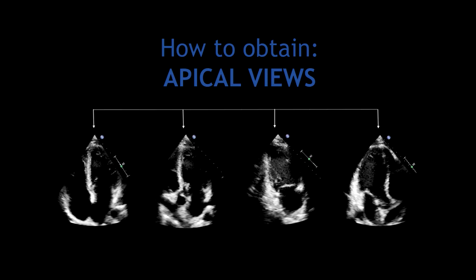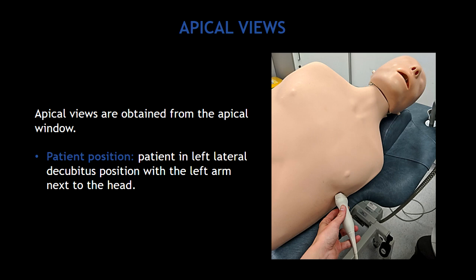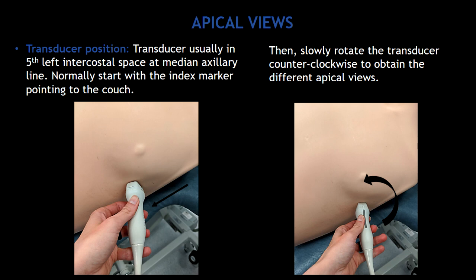Hello guys, in this video I'm going to show you how to obtain the apical views. The apical views are obtained from the apical window. The patient has to be in the left lateral decubitus position with the left arm next to the head. To obtain any apical views, first you have to place the transducer in the fifth left intercostal space at the median axillary line.